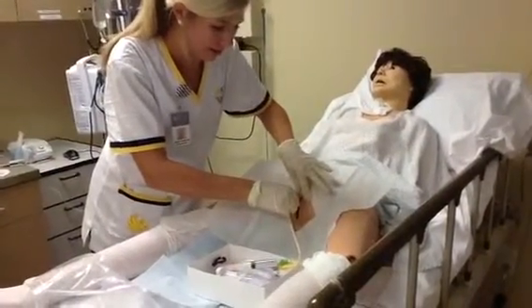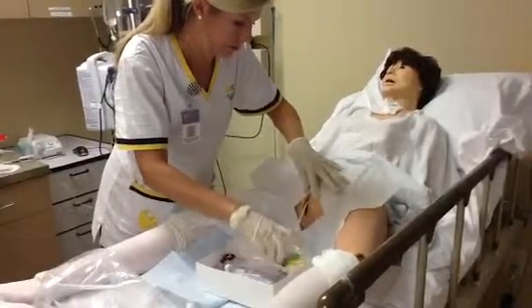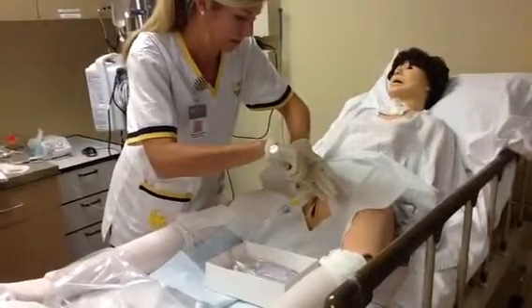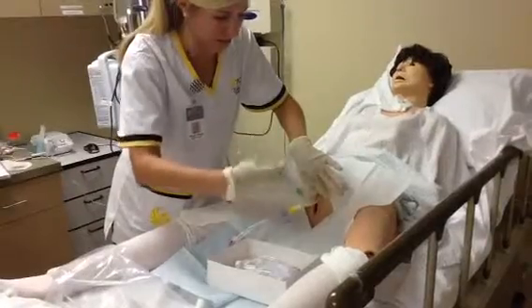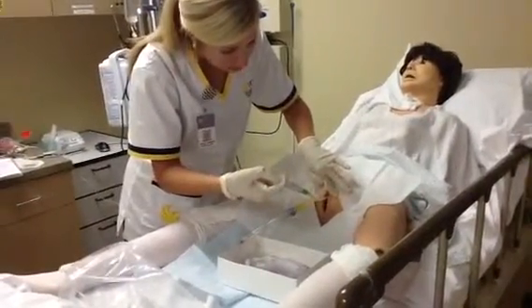So now I'm going to go ahead and inflate the balloon. Again, I have my 10 milliliters, and I'm going to insert.